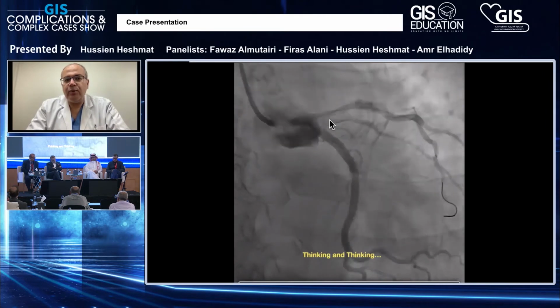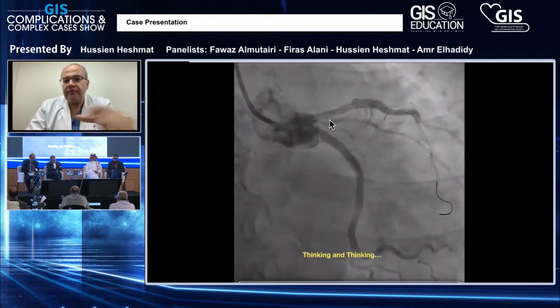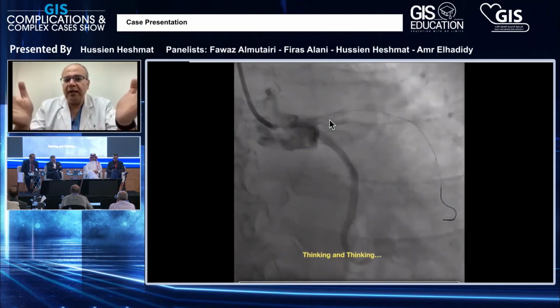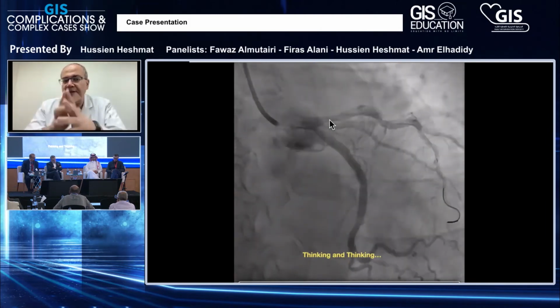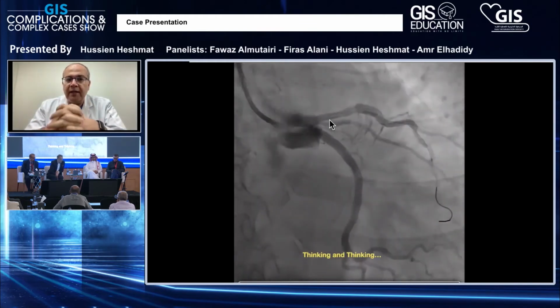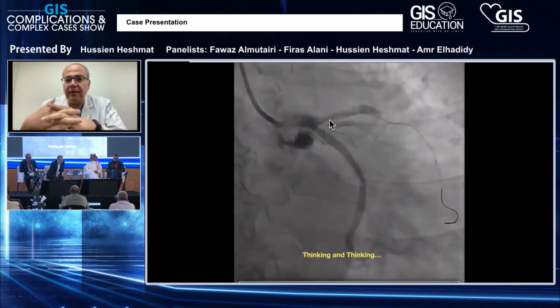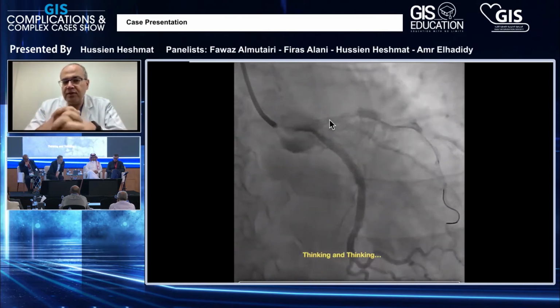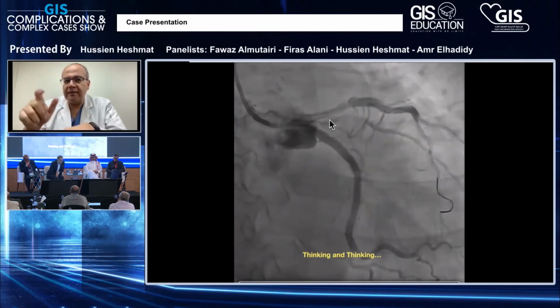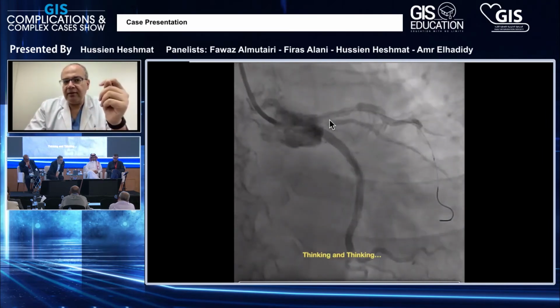Should we try to snare the stent and retrieve it, the part that's floating in the aorta? And you can see here the stent was well opposed to the left main and expanded in the left main, and also expanded in the proximal LAD. In order to snare that, we probably had to go with a ping pong. The procedure was a radial procedure, right radial, so we had a ping pong and insert a guiding catheter and a snare and take the stent on the snare.